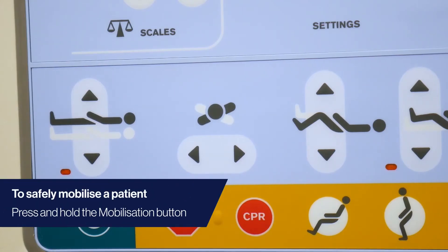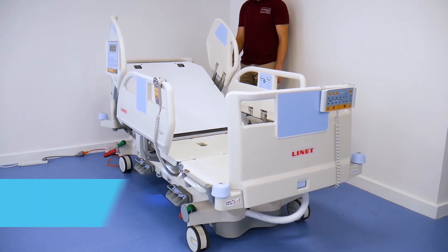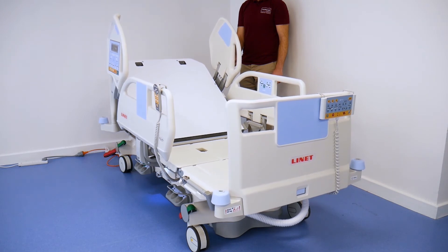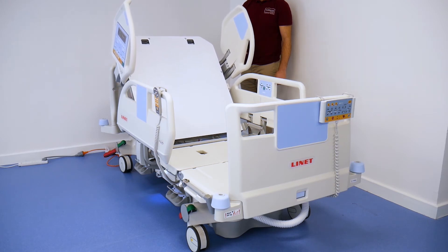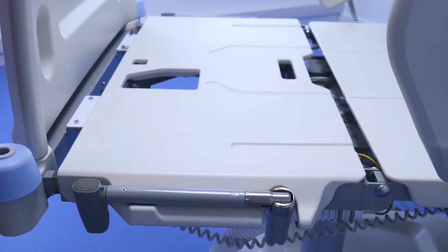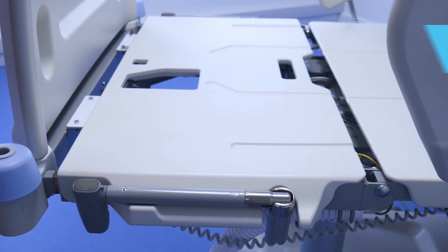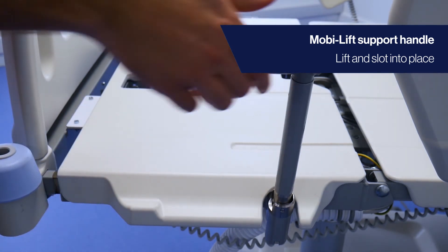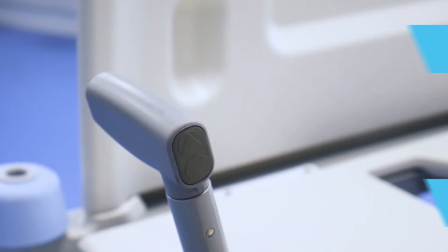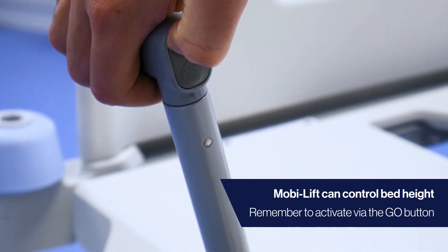To safely mobilise a patient, begin by pressing the mobilisation position button on the iBoard. This puts the bed to its lowest height and the backrest reaches the maximum angle. If the patient's feet are not flat on the floor, use the lateral tilt to ensure nose over toes. A MobiLift support handle is available to further support patient mobilisation. This can be found on both sides of the bed at the foot end. Lift the handle up towards the bed and push into the sleeve fitting until it locks. Press the go button to activate, and the patient can independently control the bed height to assist in standing.